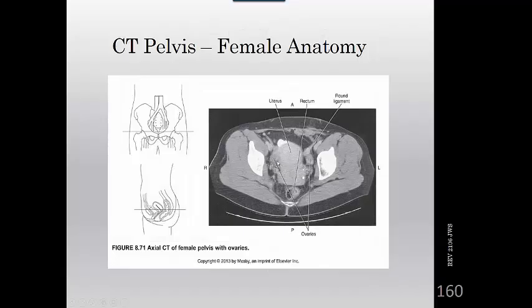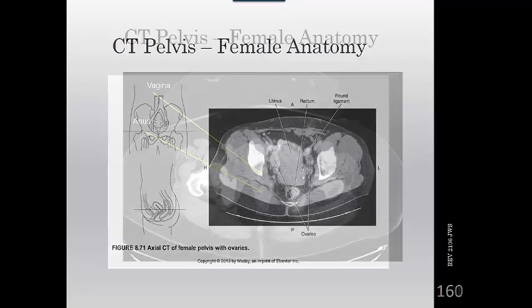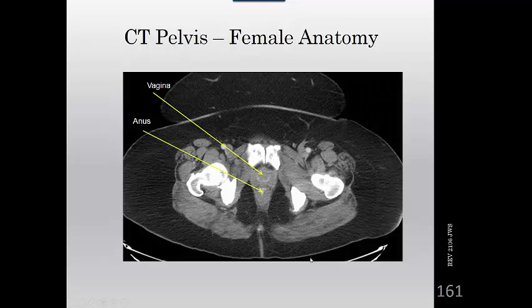Again, here's the uterus. Vagina's down in here. Here are the ovaries coming in here and here. Little dark cystic looking things. And the round ligament which holds all that together. We're below the uterus, and the uterus goes into the vagina that's headed out, symphysis pubis, and then the rectum here, femoral head and neck, acetabulum.